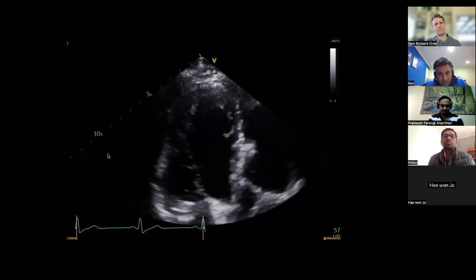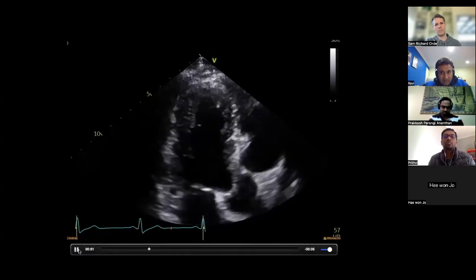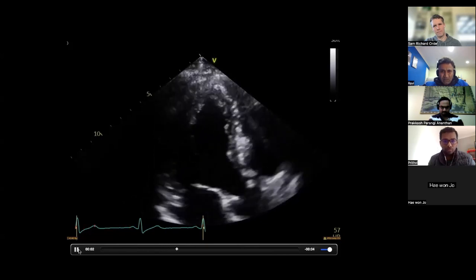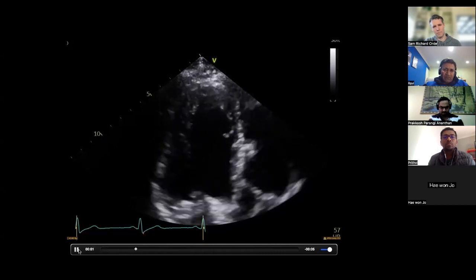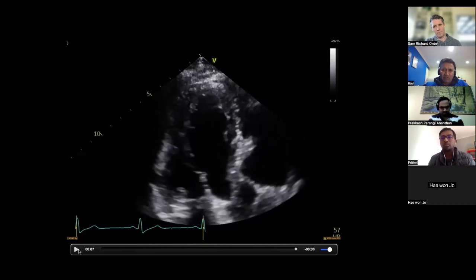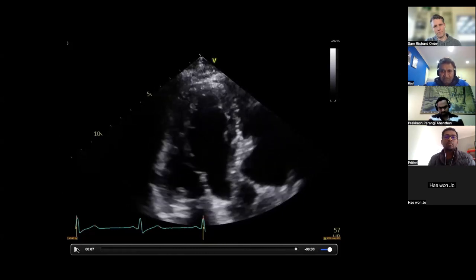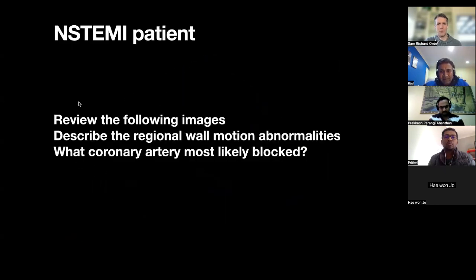So apical three-chamber view, again, this is showing anteroseptal and inferolateral walls. Any regional wall abnormality? So the basal anteroseptal appears hypo. I don't know whether that's a tethered motion, but it appears dyskinetic. Basal anteroseptal. Well, okay, so you want to put that all together for me, please?